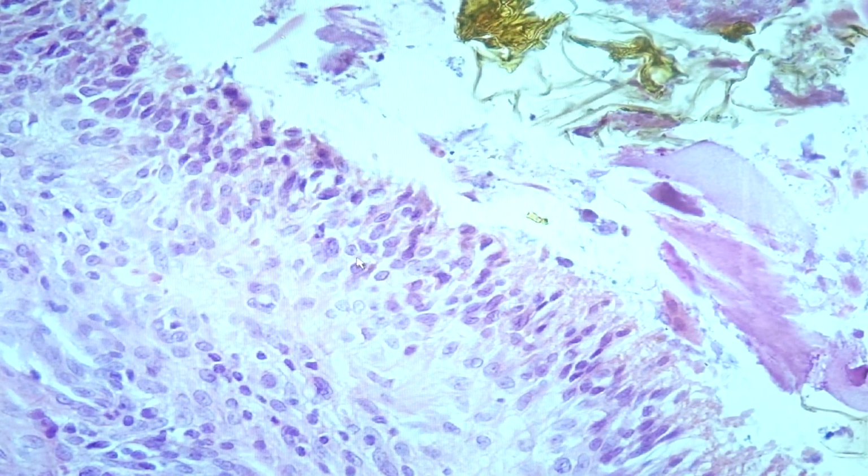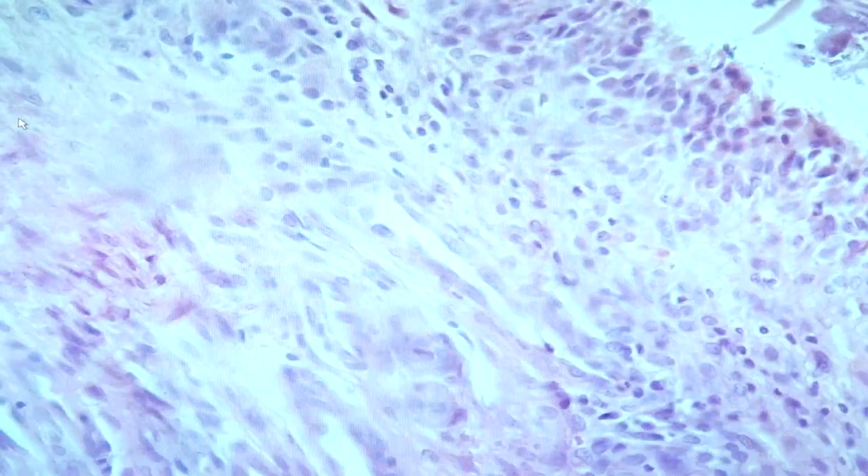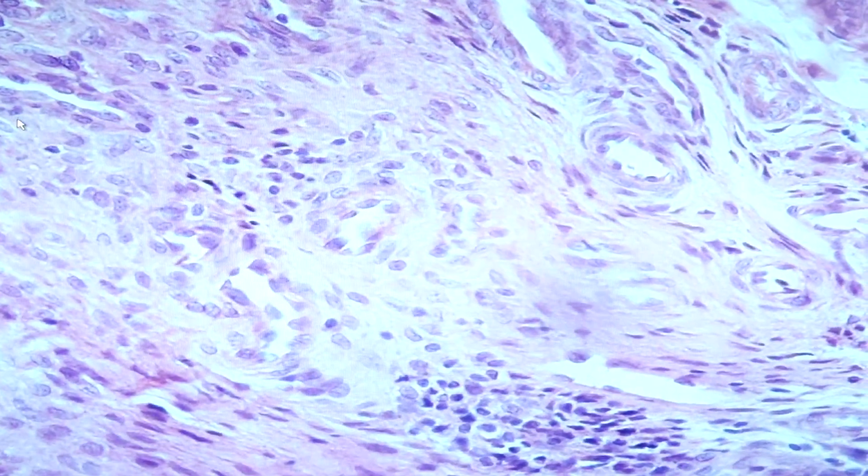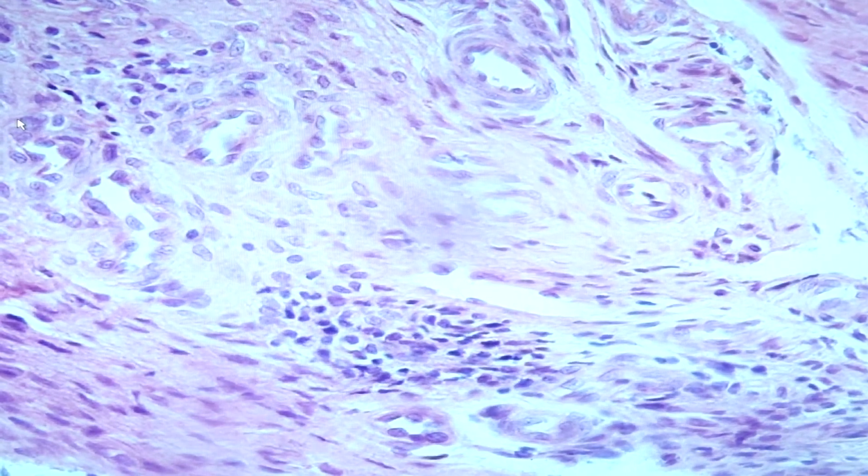It would show synovial hyperplasia. We have the presence of granulation tissue, so you have blood vessel formation, fibroblasts, histiocytes. So this is pannus.